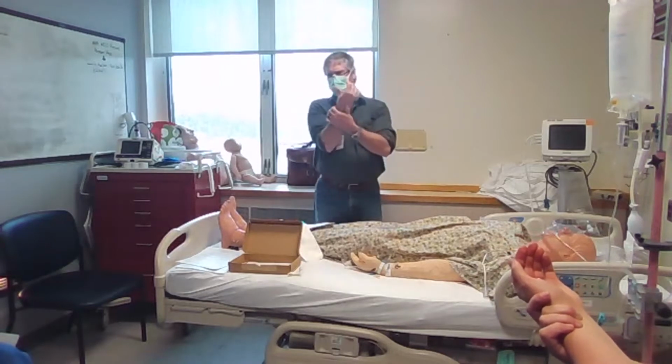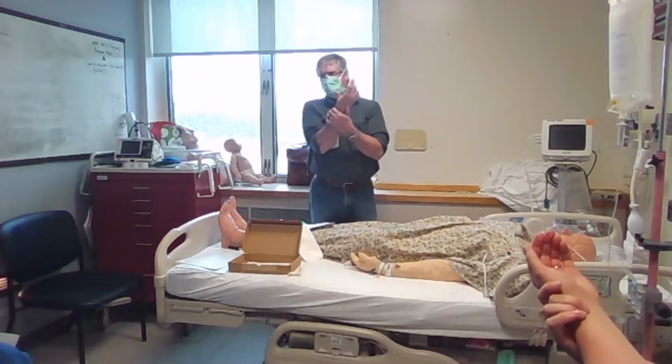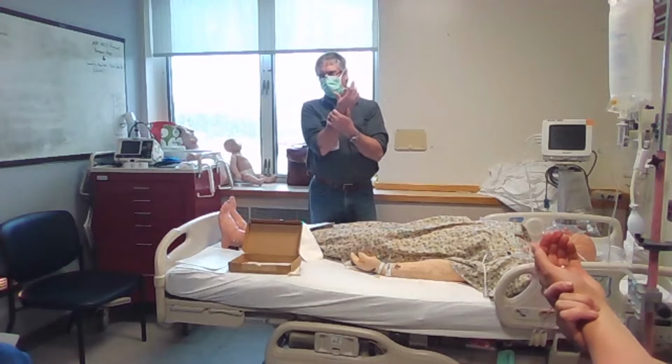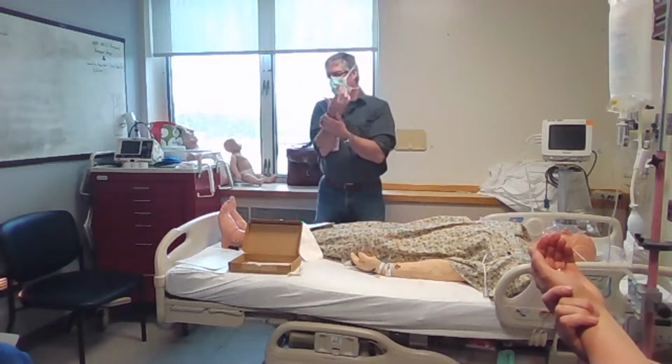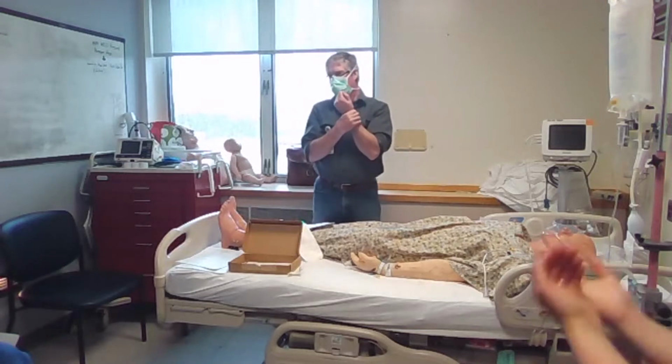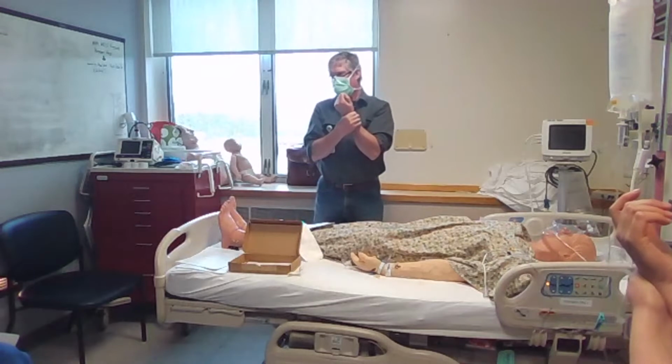It's like a little soft spot, like it would be if you're finding a vein. Then you hold in there and calmly sit and you'll feel the artery beat. And then do it with the other hand, because this is the hand you're going to use. So be able to find it with both sides.